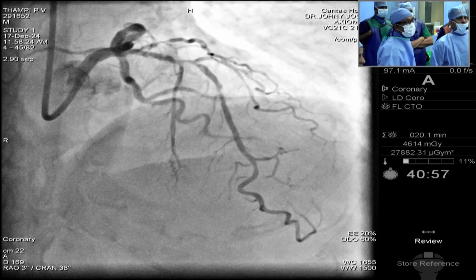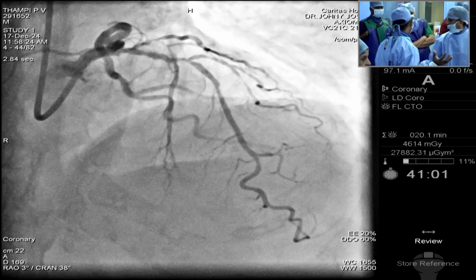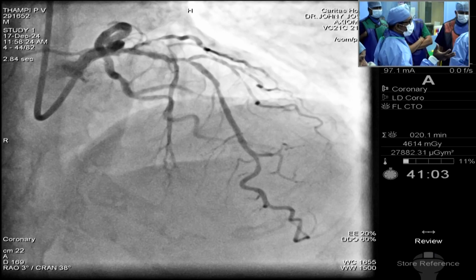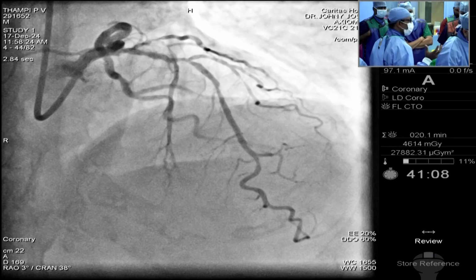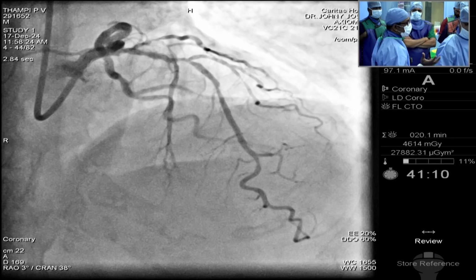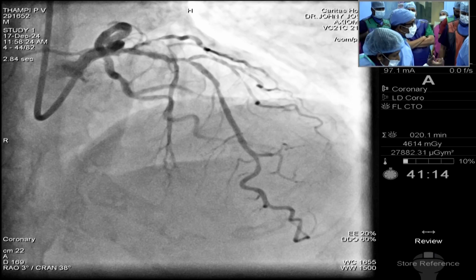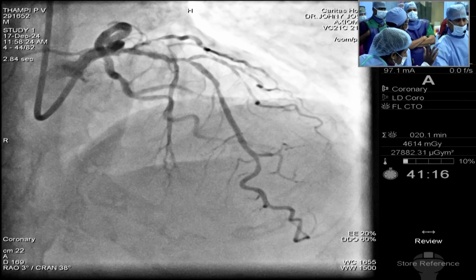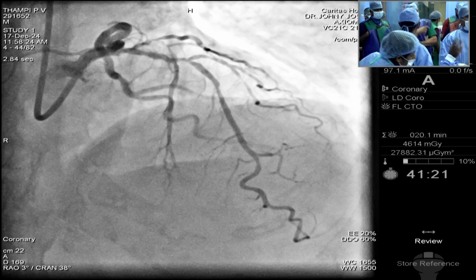should settle the issue. So what would be your strategy? Radial? Yes. We would prefer radial for this because the left main looks good and the ostium looks quite roomy. We can go with a 6 French sheath and 6 guide, wire the LAD, do imaging, then orbital atherectomy, then regular balloon dilatation and stenting. This appears to be a straightforward case. Would you have a different strategy?